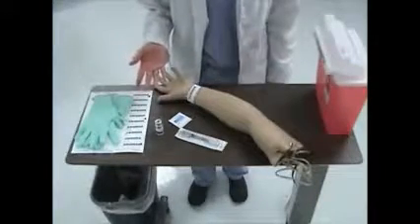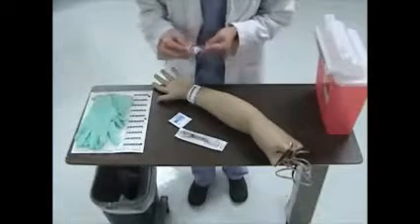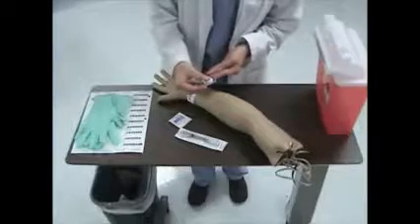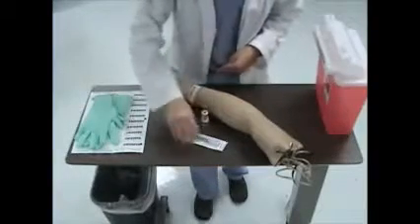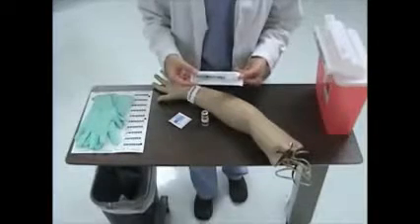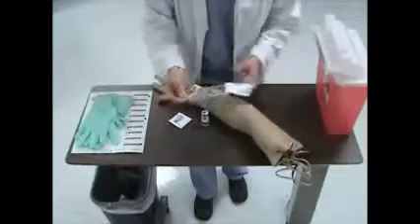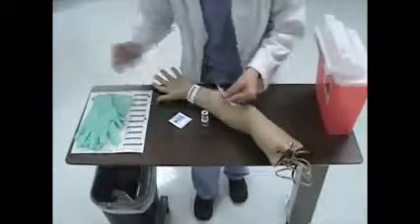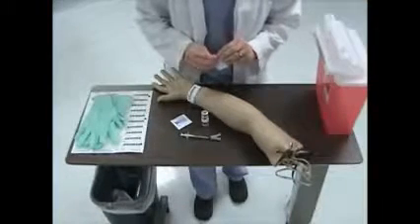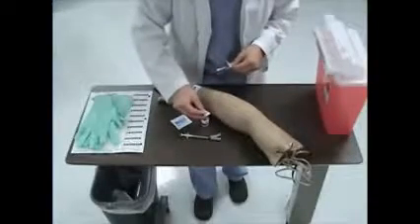Next, I will prepare my injection. I'm examining my PPD vial, checking the expiration date. I will open the wrapper of my tuberculin syringe. I will cleanse the rubber stopper of my PPD solution with an alcohol prep.